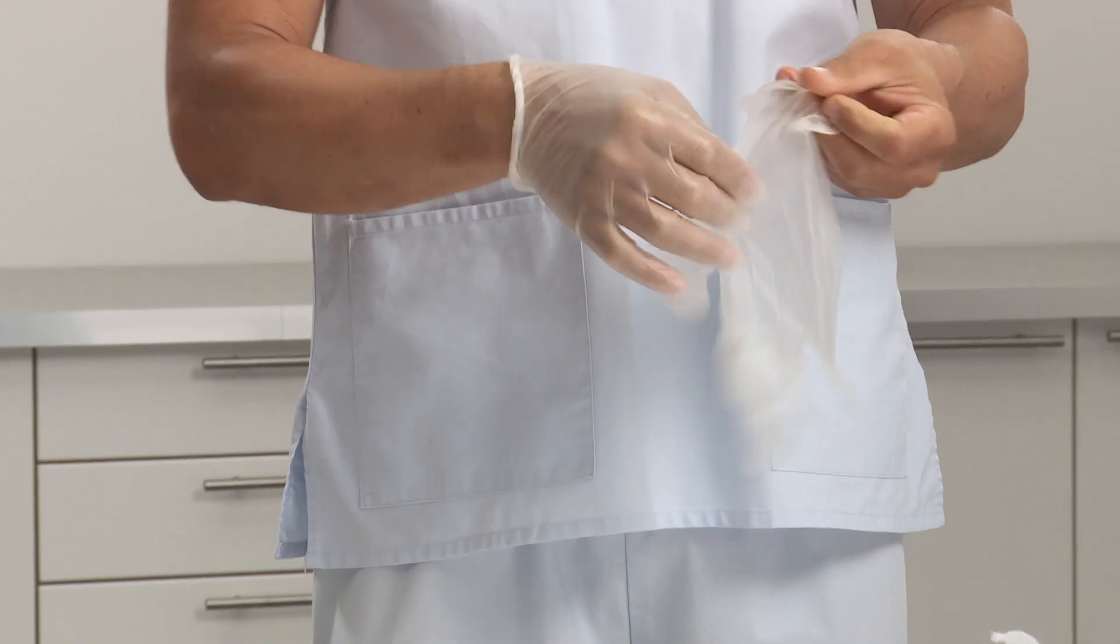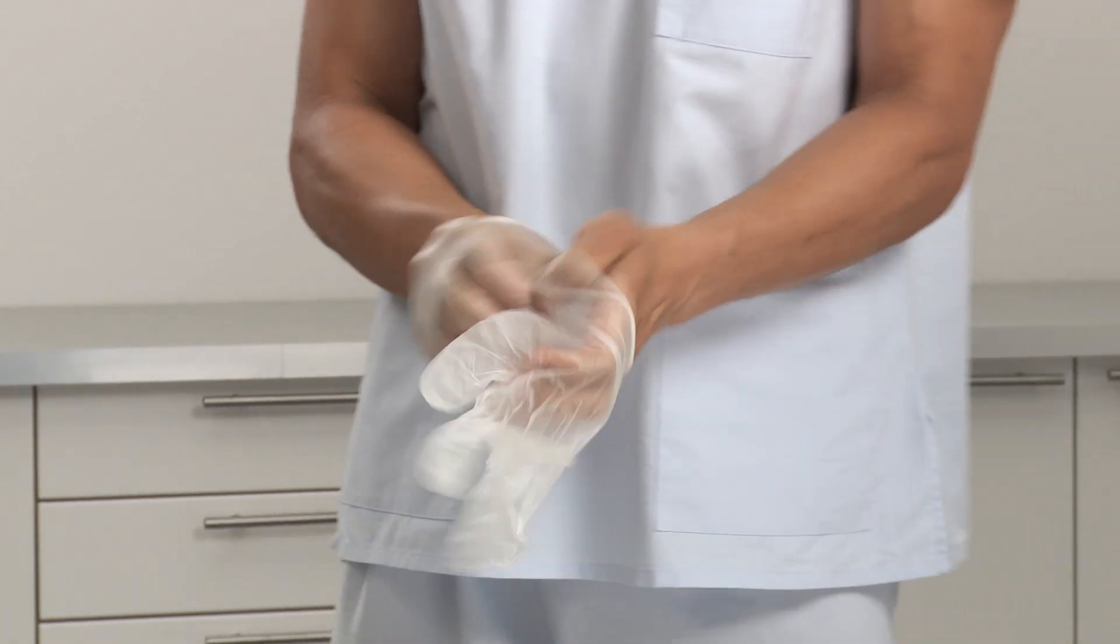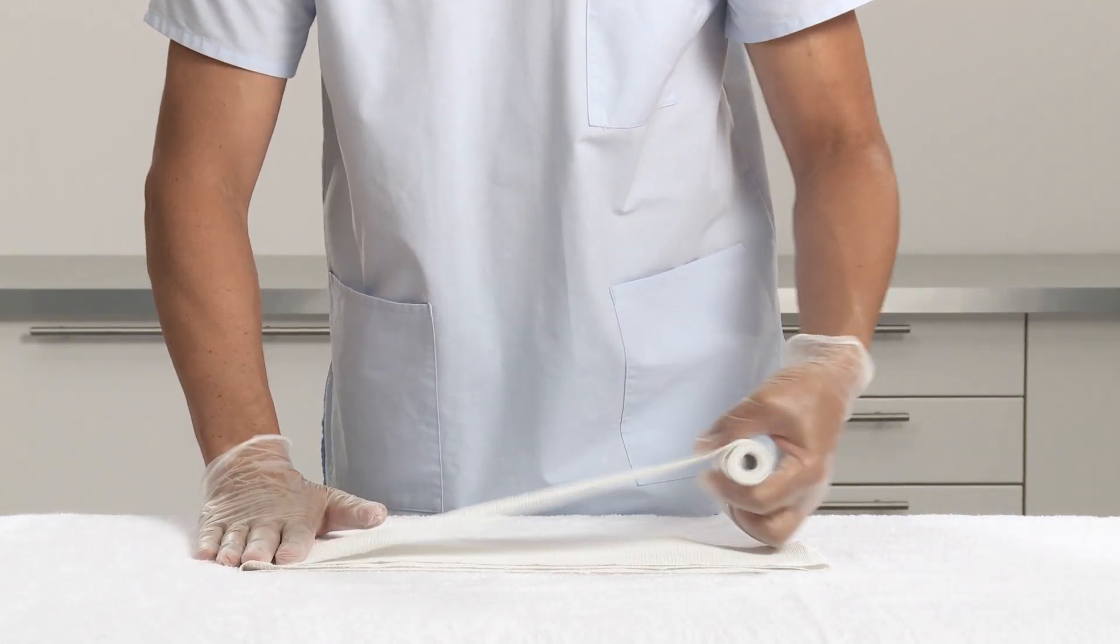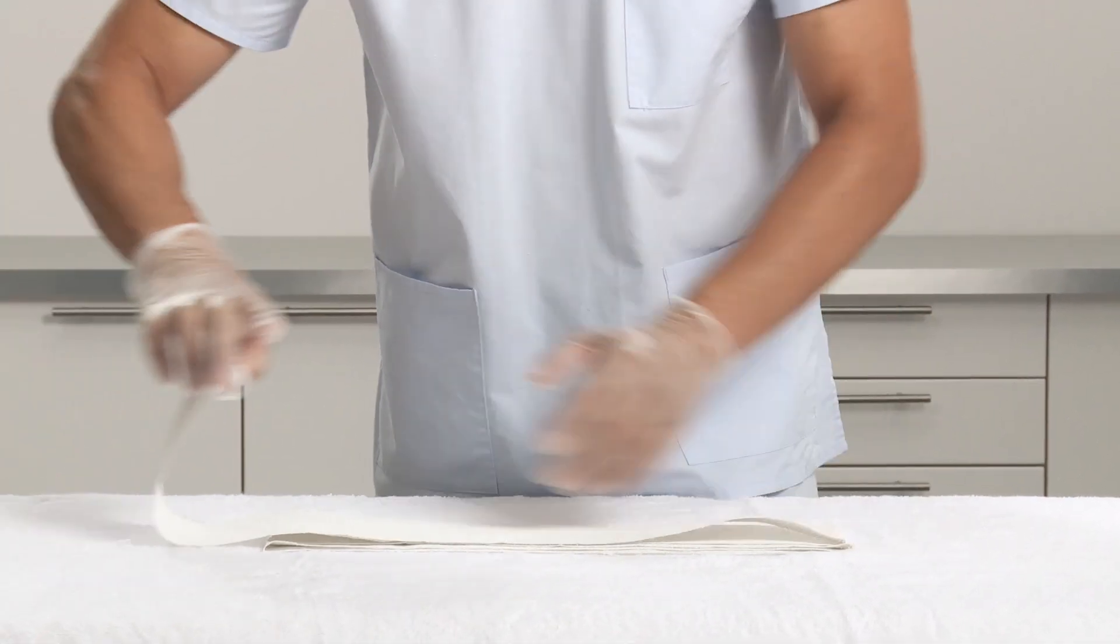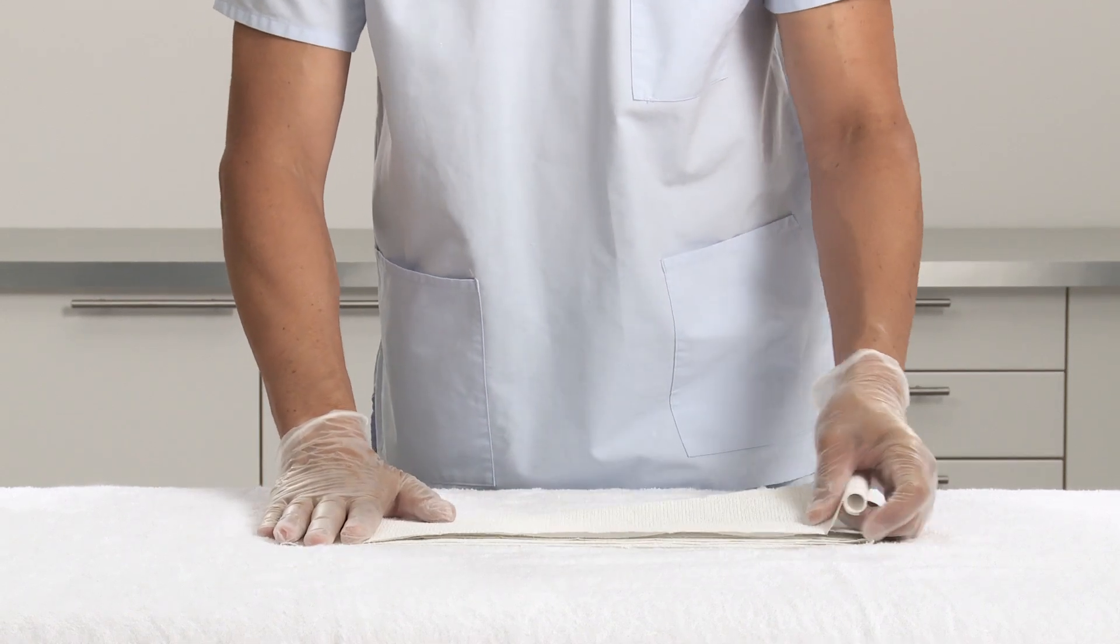It's recommended to wear protective gloves before applying Plaster of Paris. Select the appropriate width of the Plaster of Paris bandage. Fold the bandage into six layers at the length needed to fit the patient.